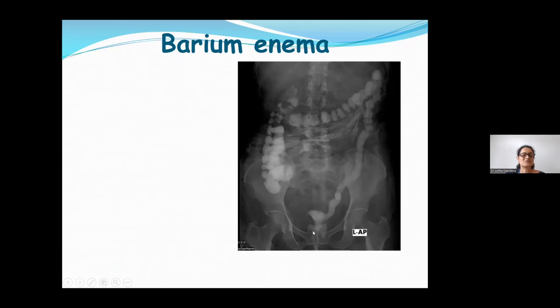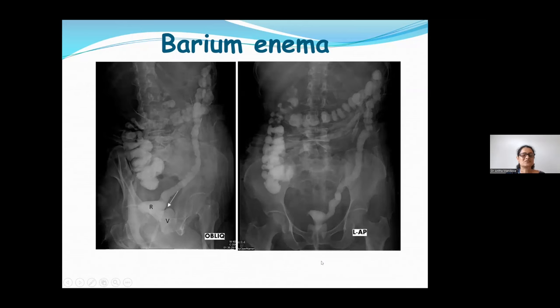Here is a barium enema in a known case of carcinoma of the rectum. We can see barium inside the rectum and cecum, and something outside the rectal contour. In an oblique view, we can very clearly see the communication between the rectum and vagina — a clear-cut rectovaginal fistula. But we don't know what is happening beyond the lumen, so we need cross-sectional imaging.